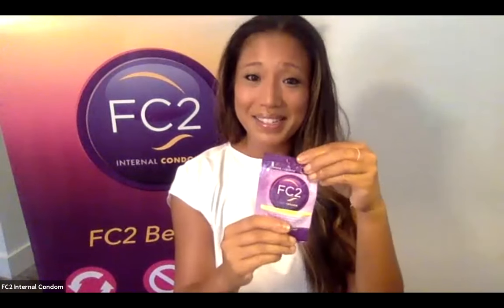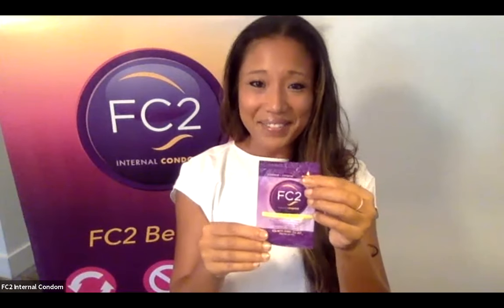Also before you open the FC2 internal condom package, it is important to rub the package gently with your fingers. The reason you do this is because the FC2 internal condom is very well lubricated so that it can be inserted into the body easily, and when you rub the package with your fingers, you're just making sure that all of that lubricant is spread evenly.